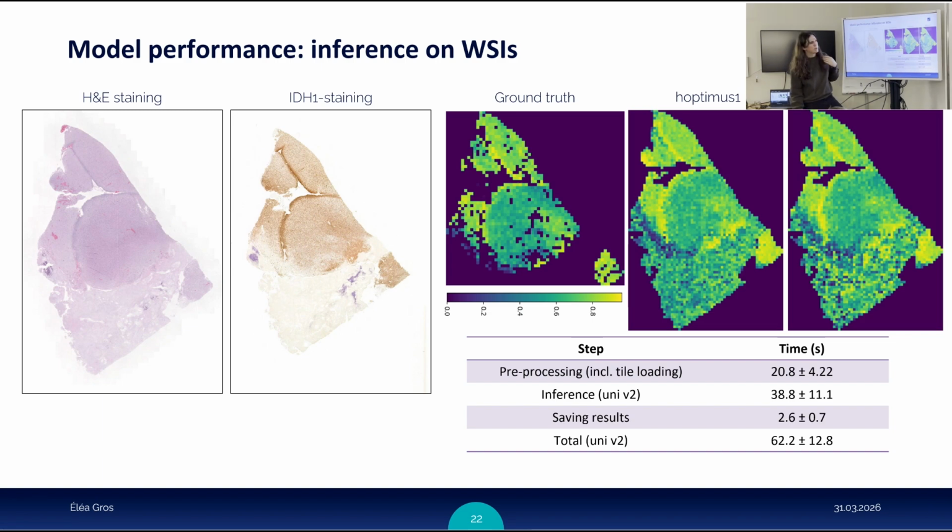What could be useful for a pathologist would be to have bigger regions which say where you have more than 70% of tumor cells. Of course, we wouldn't want a small box saying in this small box you need to take this, but something more global, maybe some average across the region.